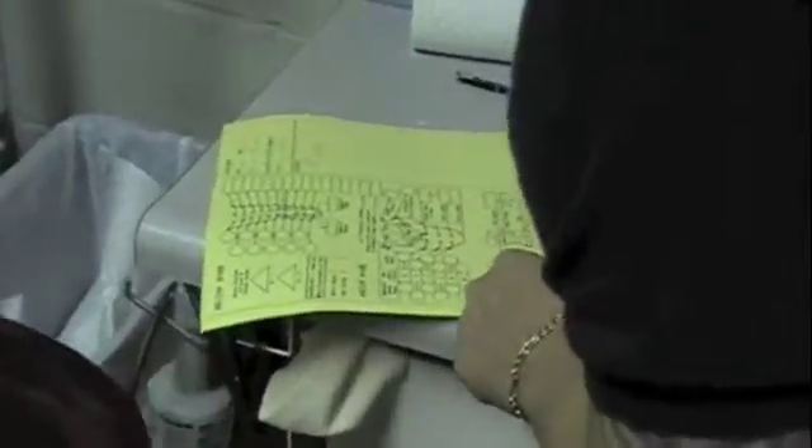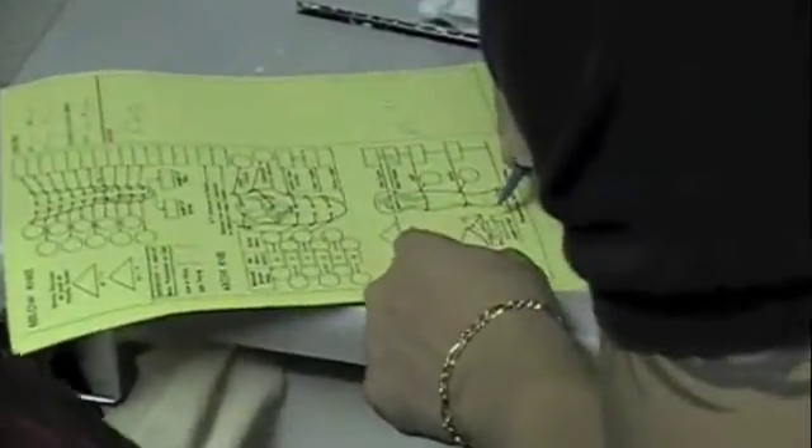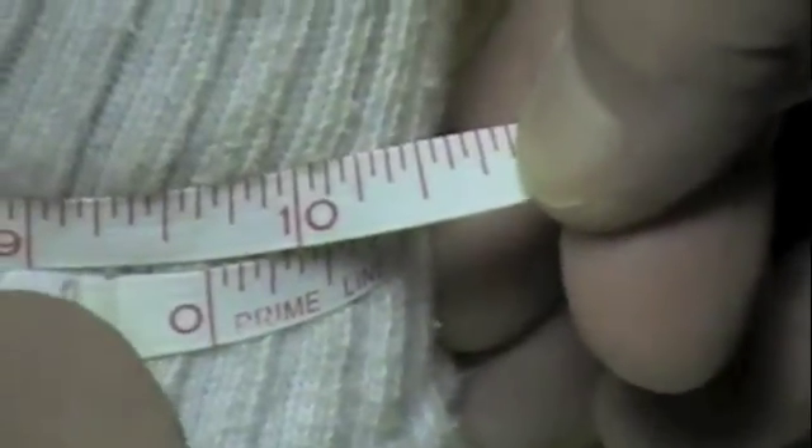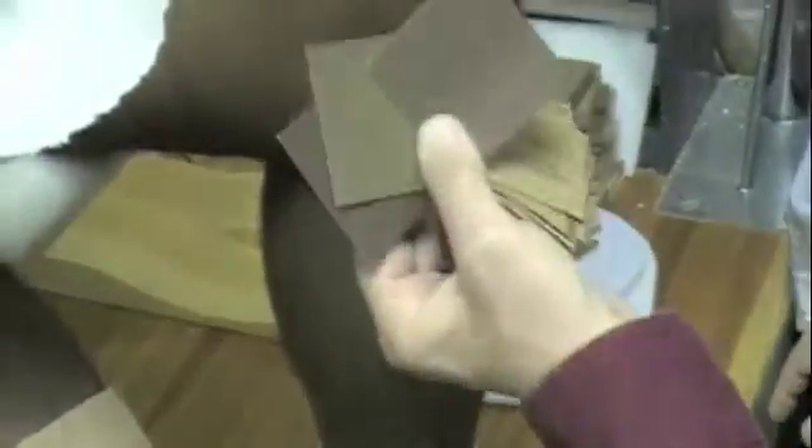You got a shoe for me? He has a right heel, yeah, a right. And color — we've got to get a match. This is how you match the color of the skin — it's color by number.